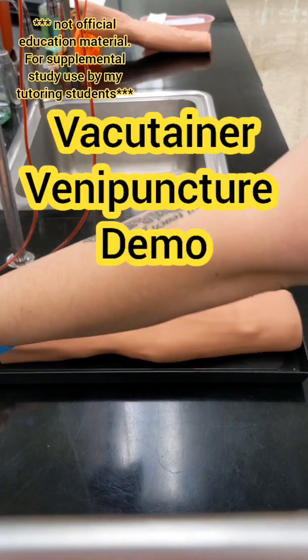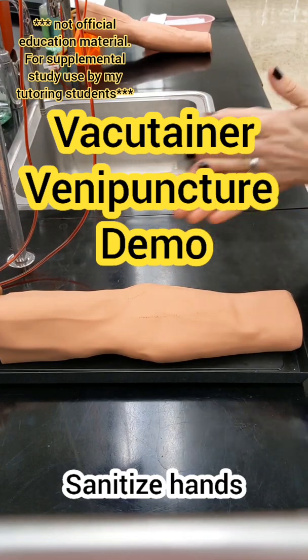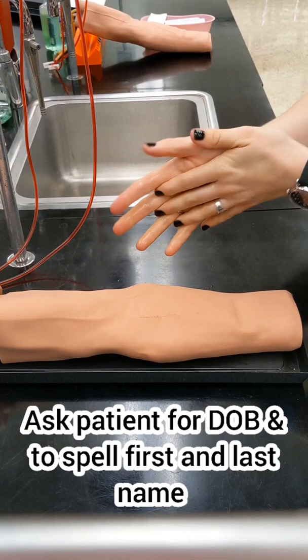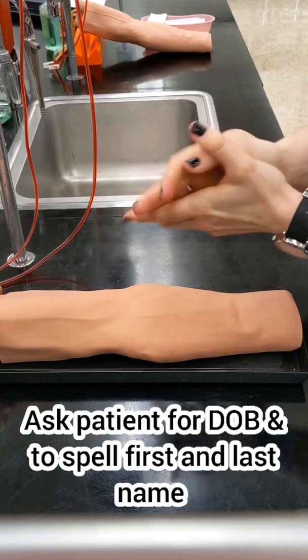You're going to always start by sanitizing your hands. Ask your patient to spell their first and last name and ask for their date of birth, and make sure you match that to the lab requisition.